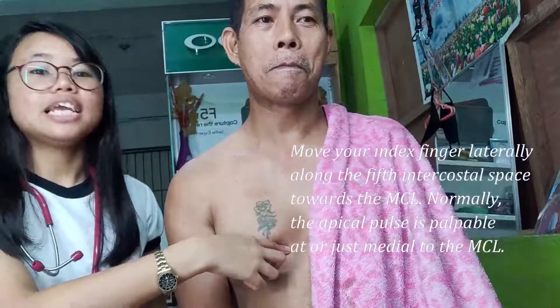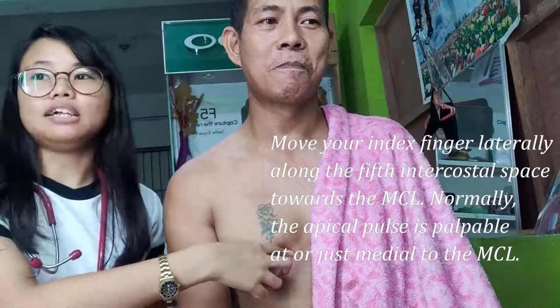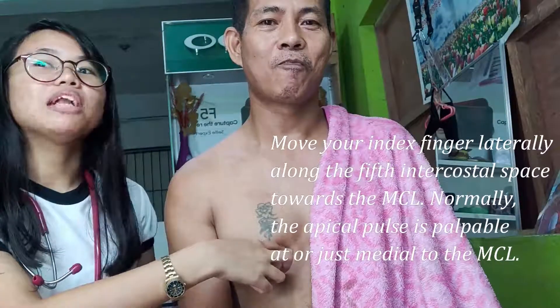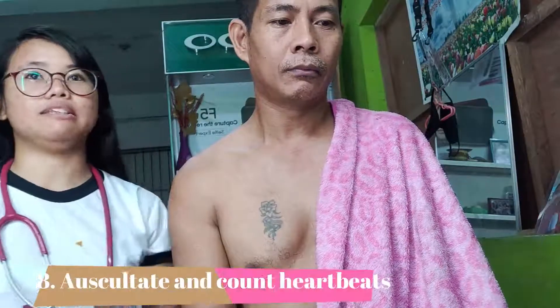Move your index finger laterally along the fifth intercostal space towards the MCL. Normally, the apical pulse is palpable at or just medial to the MCL. When you have already found the fifth intercostal space, you can now auscultate and count heartbeats.